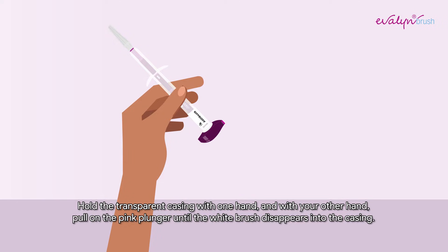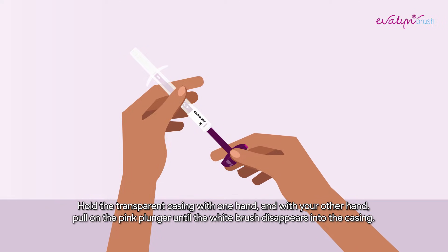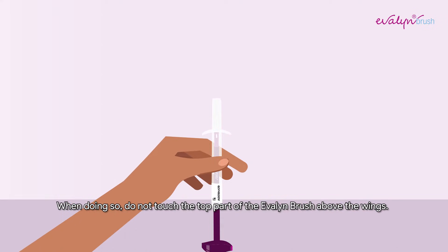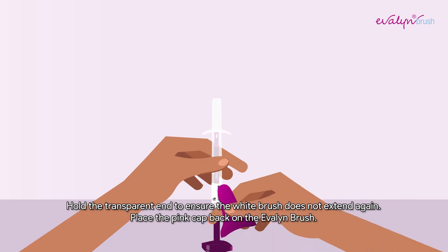Hold the transparent casing with one hand and with your other hand, pull on the pink plunger until the white brush disappears into the casing. When doing so, do not touch the top part of the Evelyn Brush above the wings. Hold the transparent end to ensure the white brush does not extend again.